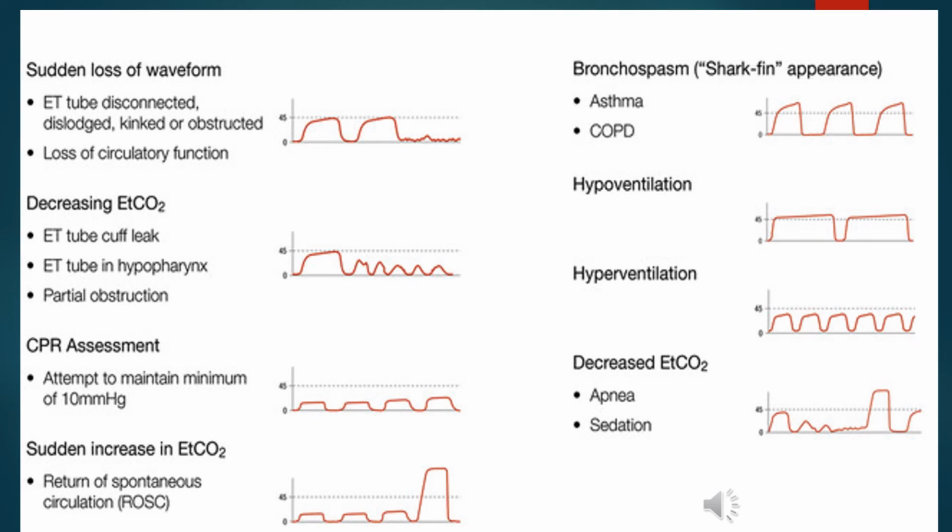So we have a kind of a normal first wave, then you go decrease, decrease, flatline, and then back up. So it's very erratic. If they had an apnea, that would be the 4th wave flatline, and then they take a breath and it would rise back up. So you get a good indication, particularly if you do have a procedural sedation and things like that, where let's say you didn't want the patient to breathe except for mechanical ventilation.